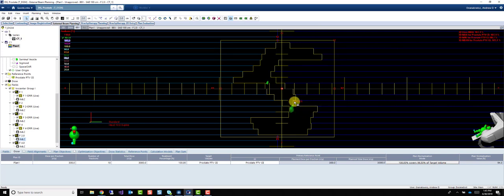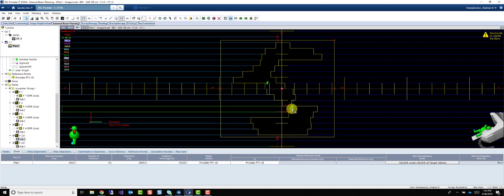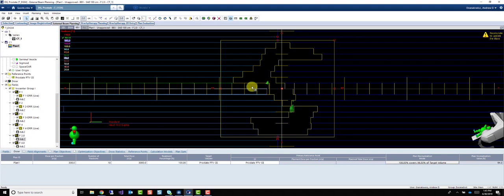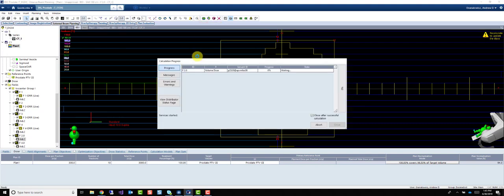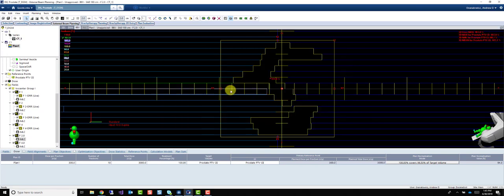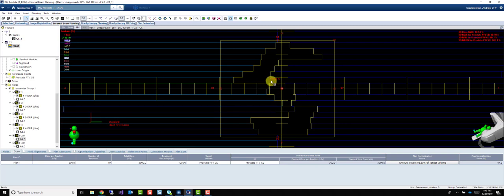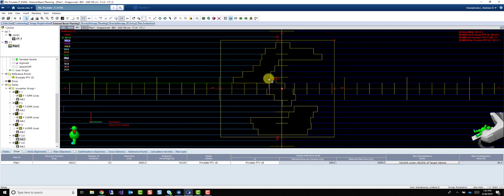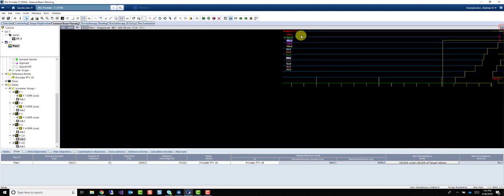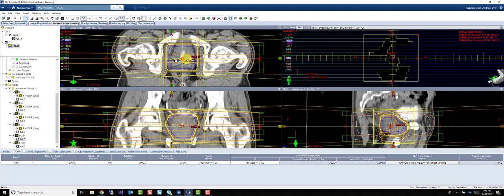So our point max dose is right there, so I'm going to barely move that one over. I'm going to move that a little bit, and that a little bit, to try to cover those areas of 107. You can see the 107's all gone. I could try to get that to go away and get it actually below 107, but I think it's probably okay.